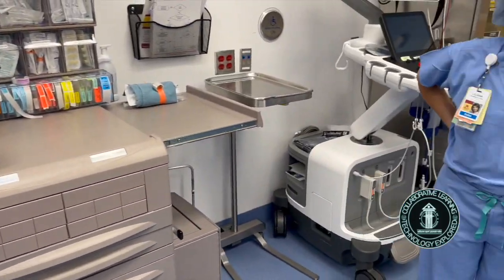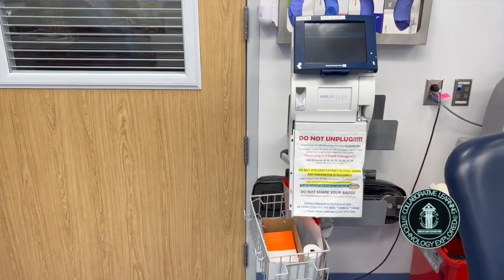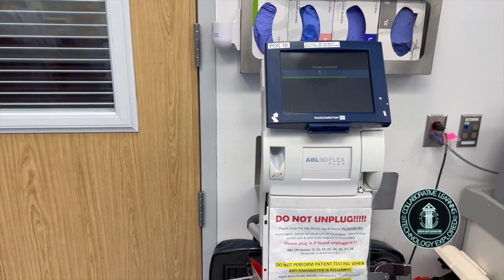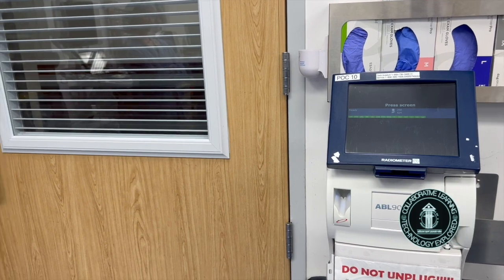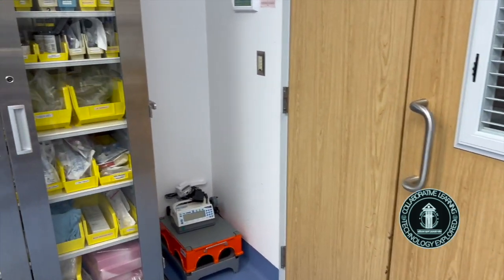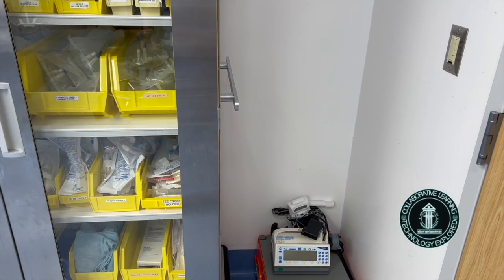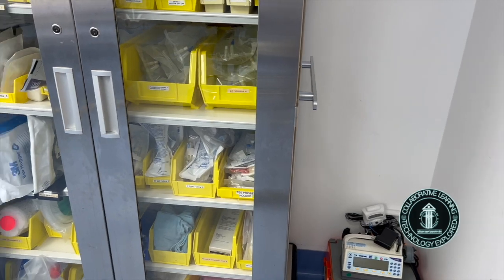Some rooms like this one will also have point of care testing for blood gases and hemoglobin, and that's available in some of our rooms, so that we can get results right away. We also have infusion pumps, as you can see here, stored, and we can get as many pumps as we need. Typically, a case will have 3 or 4 infusion pumps.